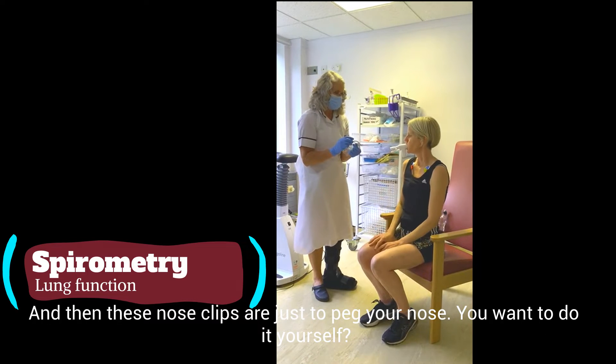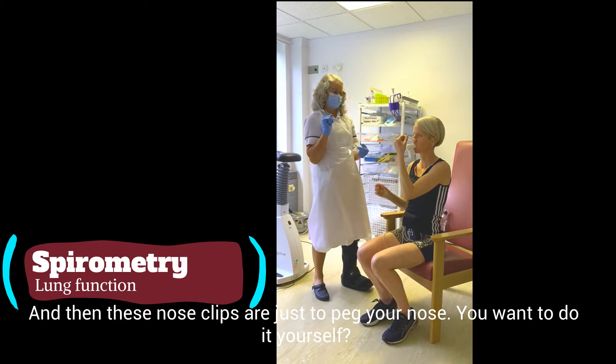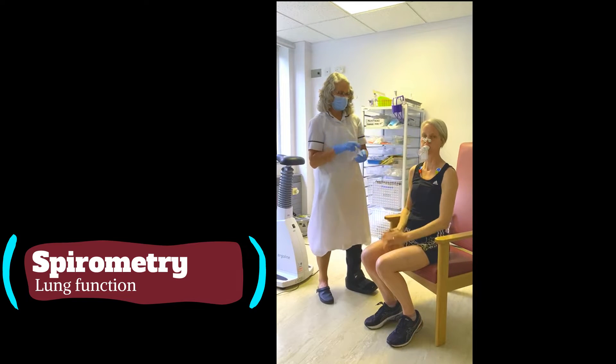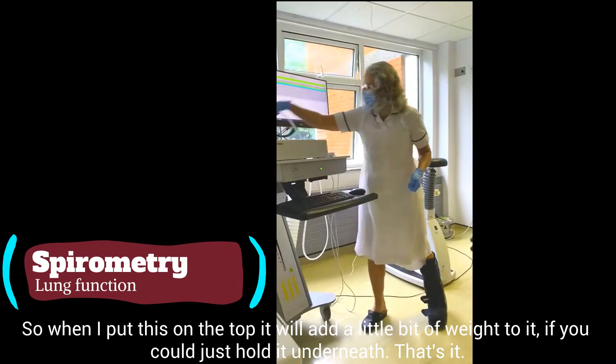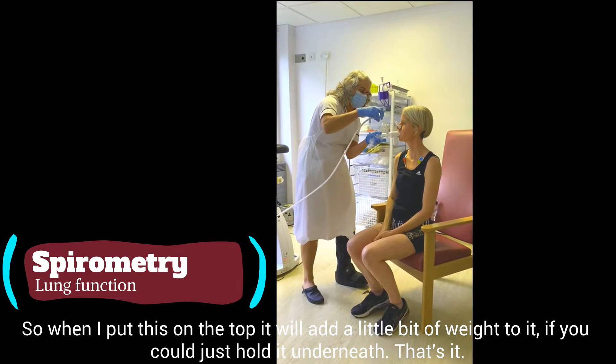And then these nose clips just have to peg your nose. Right then, so when I've got this in the top, this is going to add a little bit of weight to it, so if you could just hold it underneath.